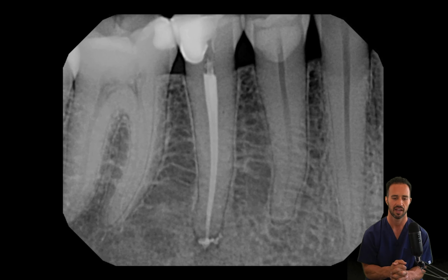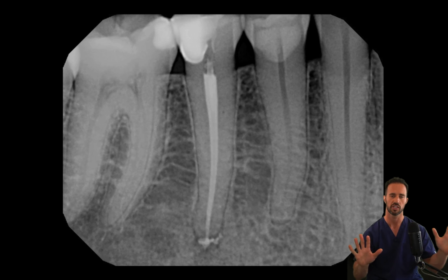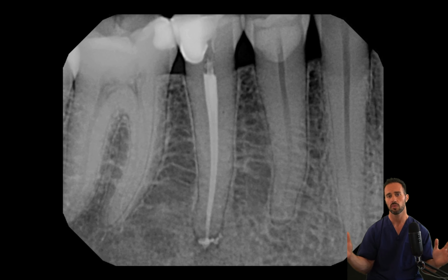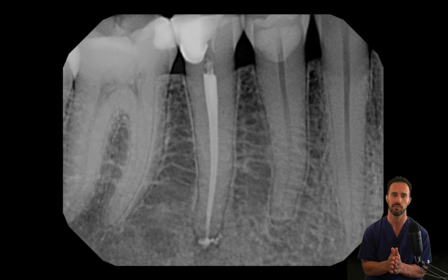And we can see there, after we've taken off our rubber dam, we've taken our post-op radiograph, and our obturation looks good. The gutta percha is well adapted to the walls. It's at a length that I feel comfortable with, and you can see the temporary restoration there. So the patient was very, very happy, okay, obviously, because this treatment was performed in such a time-efficient manner with no pain, and they did very, very well and went back to their restorative dentist or their general dentist in order to have the tooth restored.